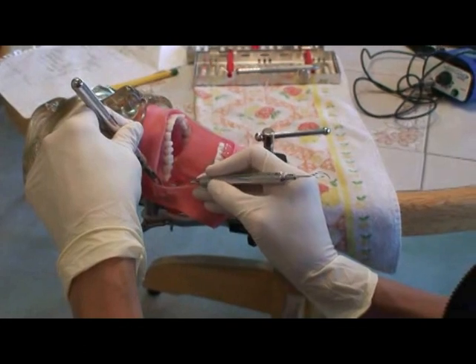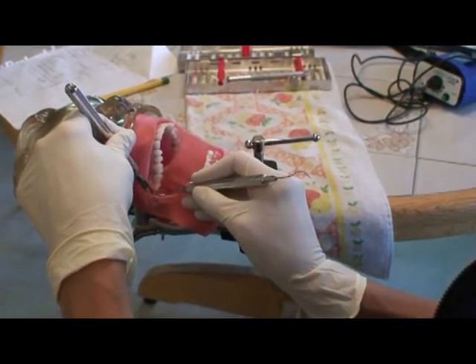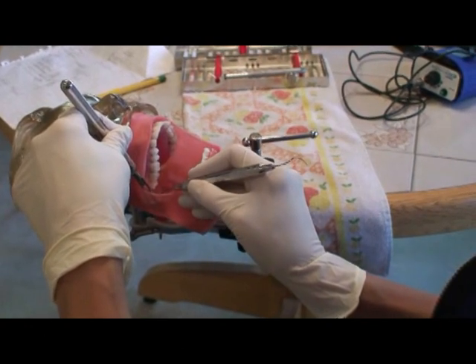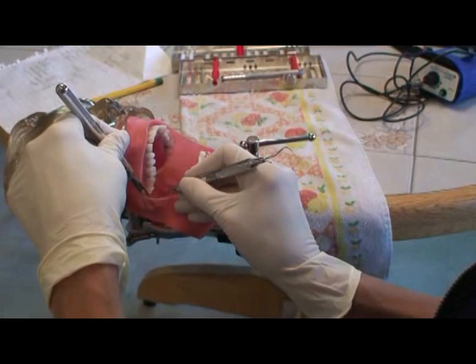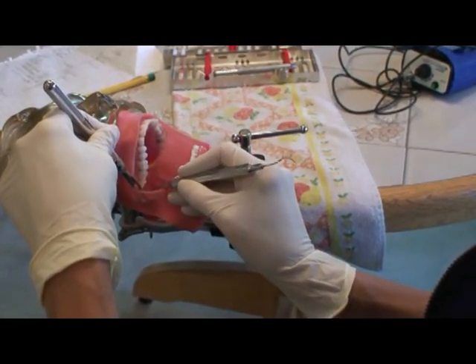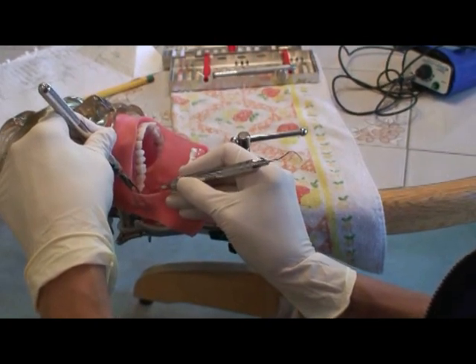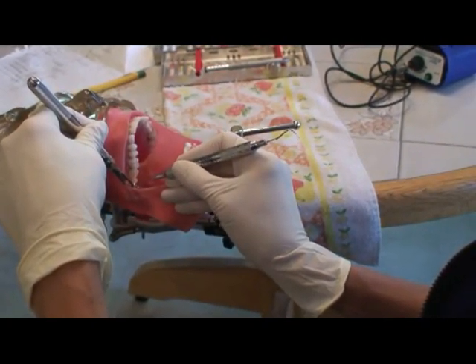Okay, the upper right facial, posterior, extraoral fulcrum, pointed mesially. Walk it distal on the trailing edge. Come back. Open the door. Roll it down.